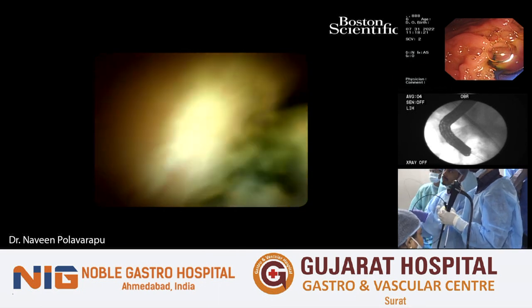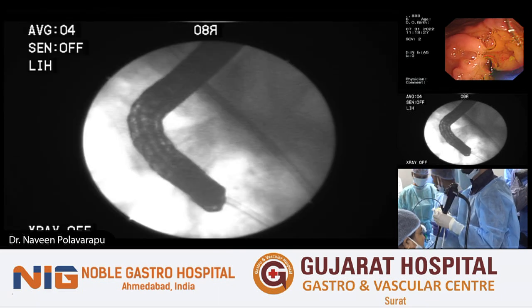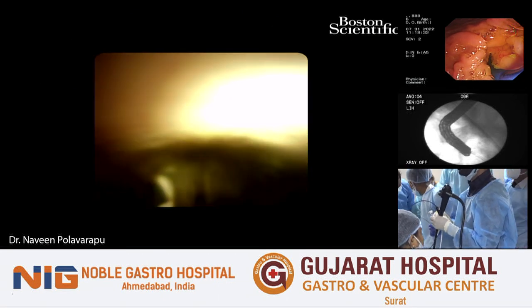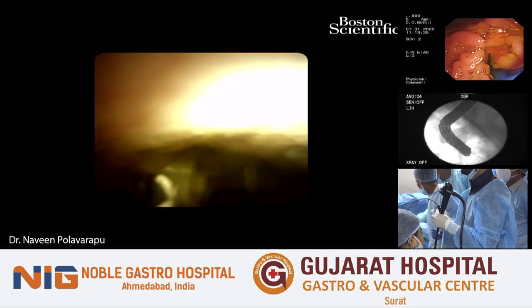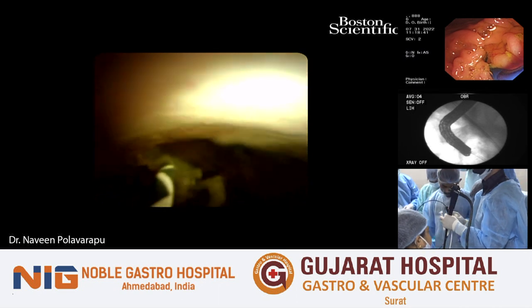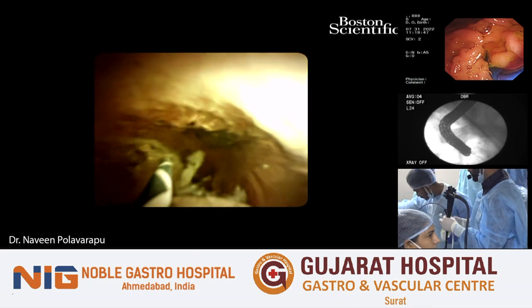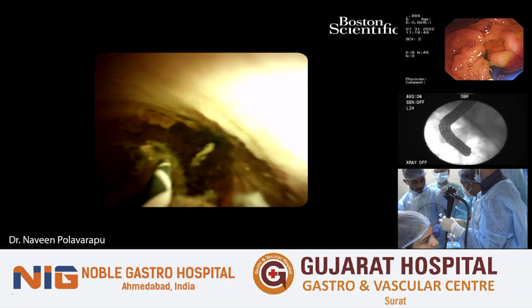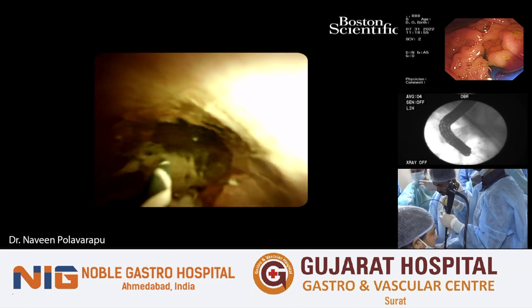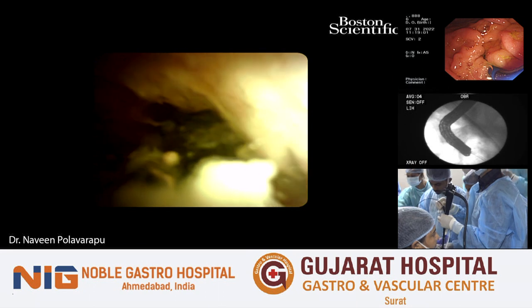I think the mistake that we probably made was we put a lot of contrast. That's why you're not able to get good views. I'm just constantly flushing it, but you can see there's a lot of viscous stuff in here. Would you normally do suction as well? Yeah, put water and suction and try to flush out as much contrast as you can. Yes, absolutely.